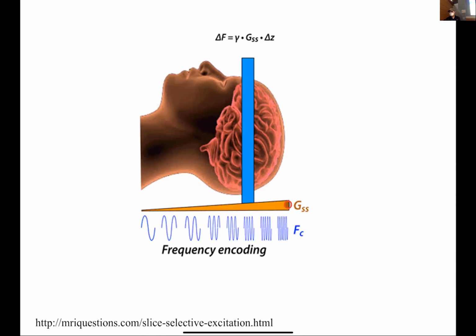So that means to excite these spins, if we can just apply frequencies in this bandwidth, then we're only going to give these spins the resonant frequency they need. And these spins here, because they want to precess at a different frequency, if our pulse only has these frequencies, then they're not going to be excited. Okay, so remember, to excite the spin away from equilibrium, you have to excite it with its resonant frequency. Right? If you excite it with some other frequency, it's much more likely to just stay close to the equilibrium point.